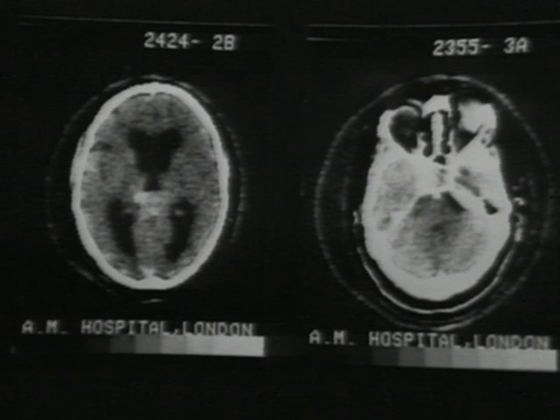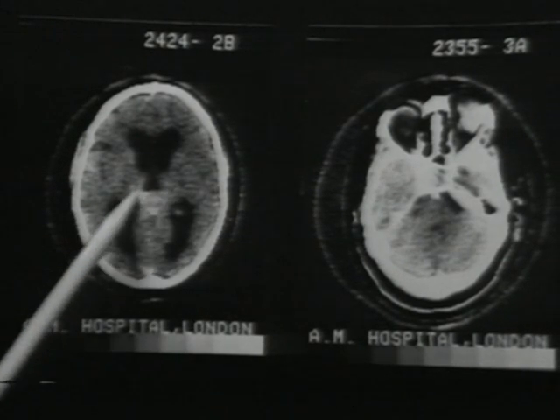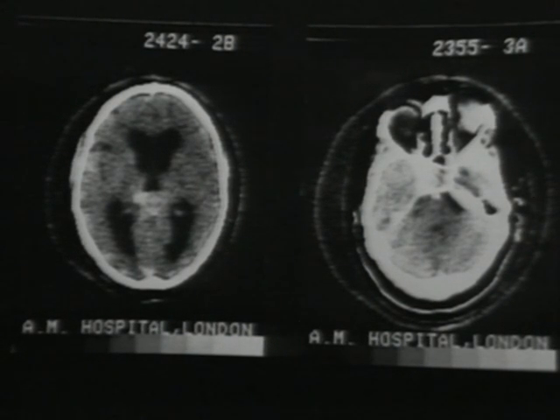Now, the suprapineal recess is usually obliterated and we can't see it. Here is just such a patient. Here is the tumor of slightly increased density occupying the posterior portion of the third ventricle, obstructing the outflow of cerebrospinal fluid and causing ventricular dilatation.